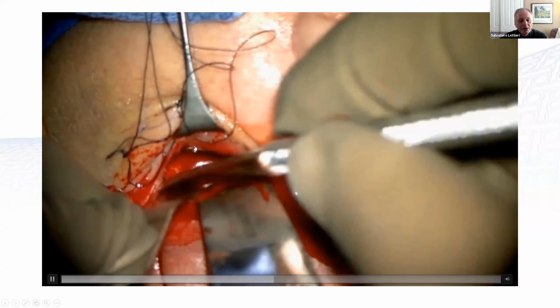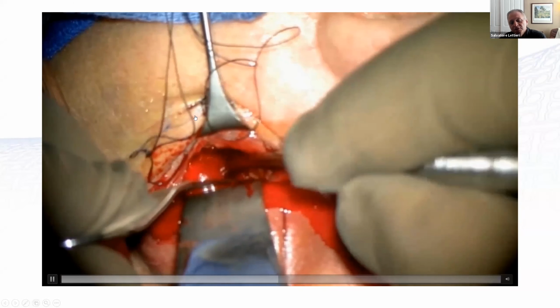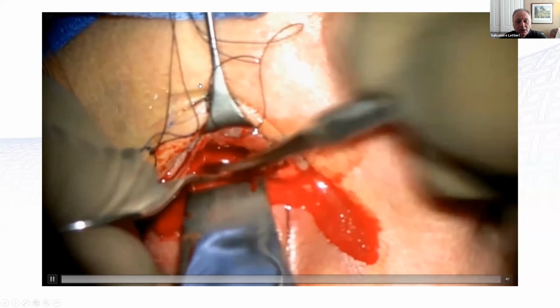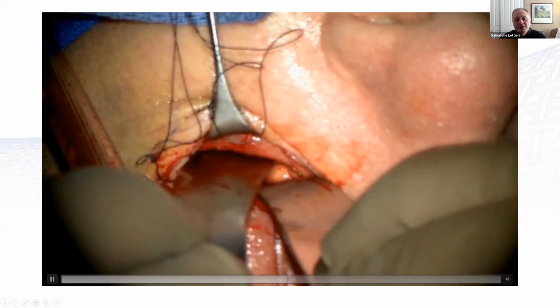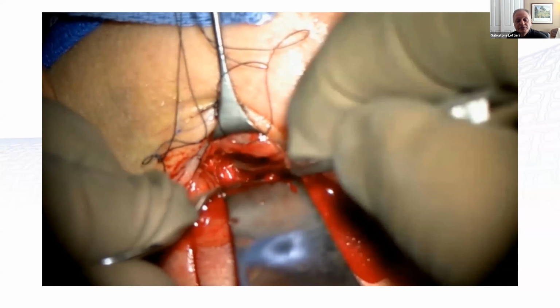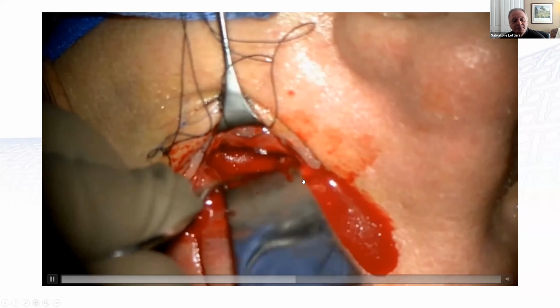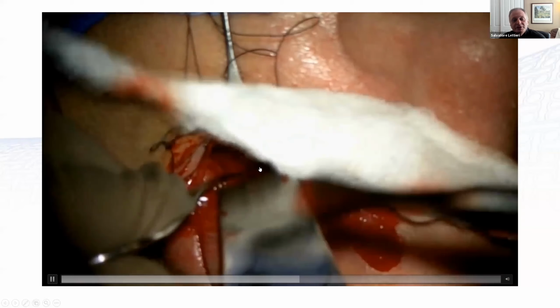When I do this doggy paddle technique, I can actually hold the second malleable with one malleable, so I can do it with one hand. Ian Jackson actually used to have a spoon for this that he had sterilized, just a kitchen spoon. And he had the tablespoon and a teaspoon, but we can't do stuff like that anymore. That was some 30 plus years ago. And that would be certainly off label.